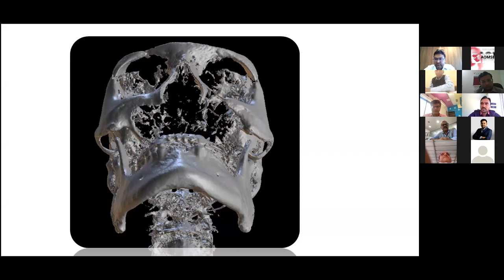And in the whole maxillary rehab cases, I guess, you need to balance between the plus and minus. So according to the patient's affordability, according to the given clinical and radiological analysis, we have to make the choice. If the cost is not a problem, then in this case I would go for PSI. Second choice will be the zygoma. Okay, that's fine.